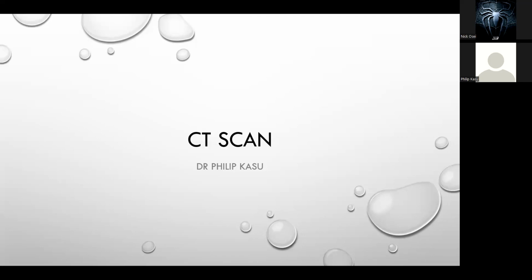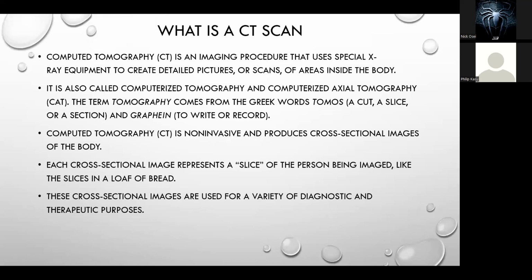So then, we start. All right, so what's a CT scan? CT scan simply refers to computed tomography. It's an imaging procedure that uses special X-ray equipment to create detailed pictures or scans of areas inside the body. So basically, a CT scan is just an advanced form of X-ray. That's basically what a CT scan is.